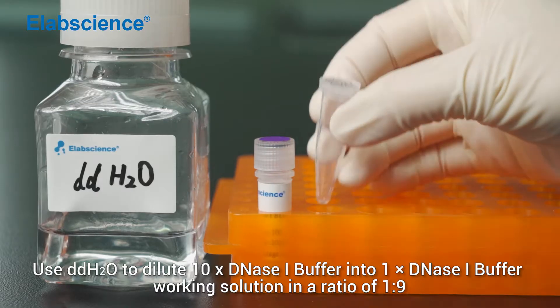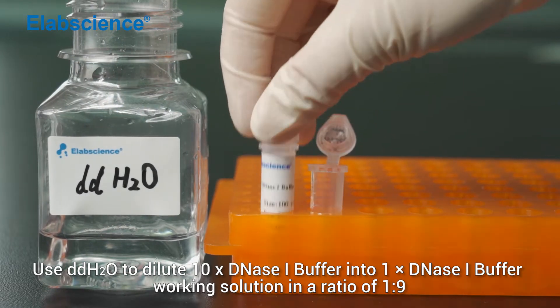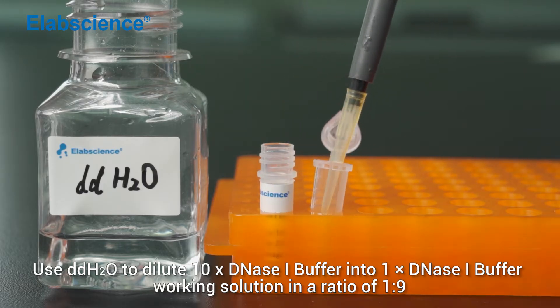Use double-distilled water to dilute 10x DNS-1 buffer into 1x DNS-1 buffer working solution in the ratio of 1 to 9. Mix.